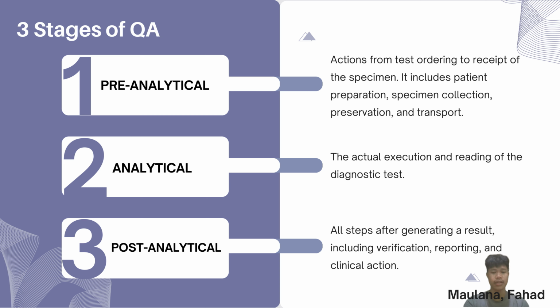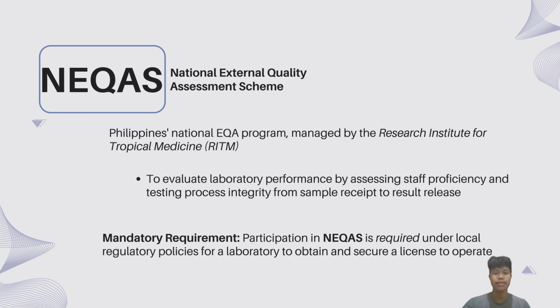Finally, the post-analytic phase ensures accurate result reporting and interpretation. Each stage must be carefully monitored to prevent errors that could compromise patient care. Moving on, let's discuss the National External Quality Assessment Scheme, or NEQAS.